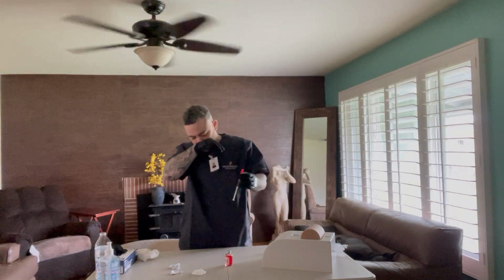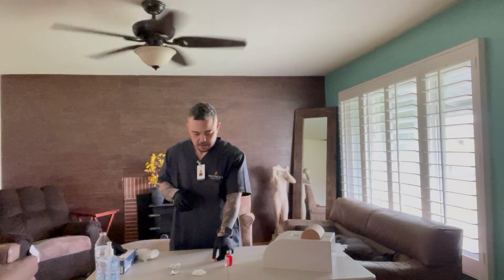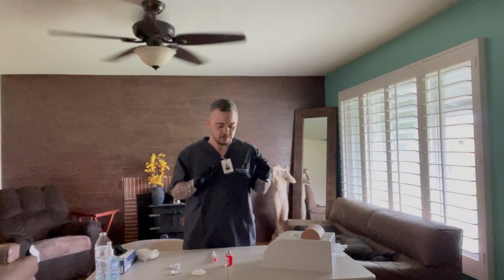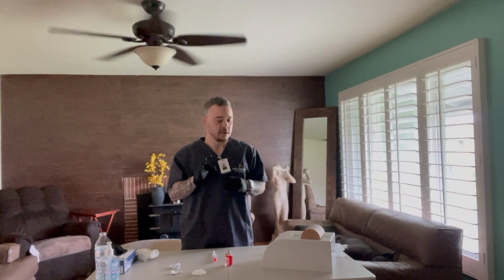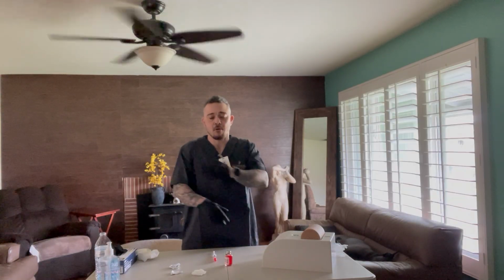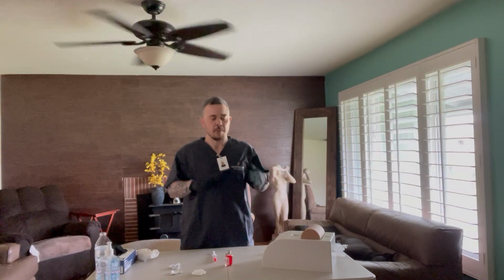Okay, so now since that is done, the next thing I'm going to do is choose the site of where we're going to put the injection. There are 3 places that you can inject, and that would be the abdomen, the back of the arm, or the upper thigh.